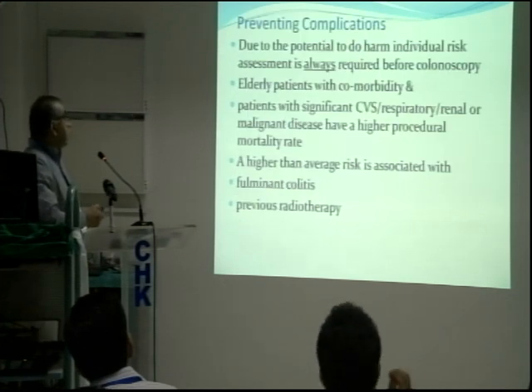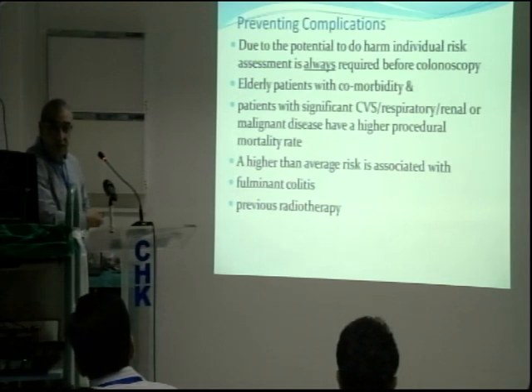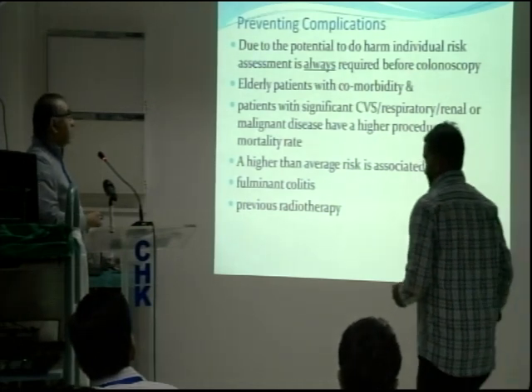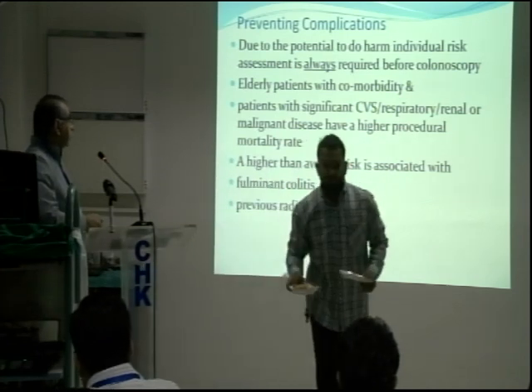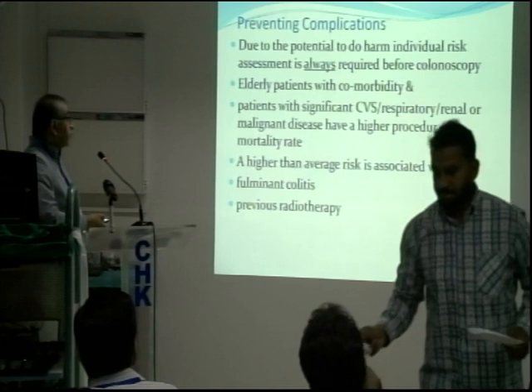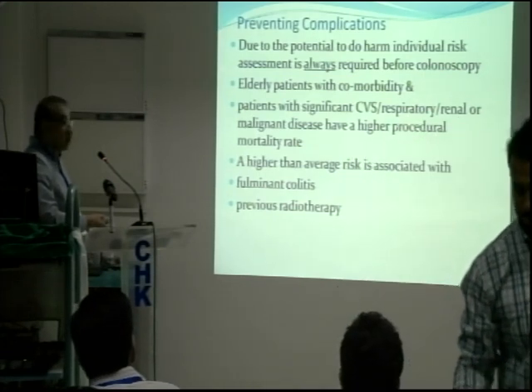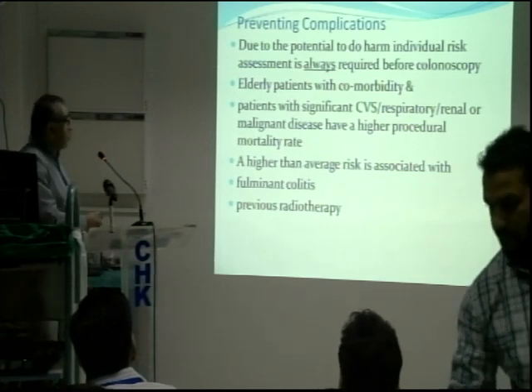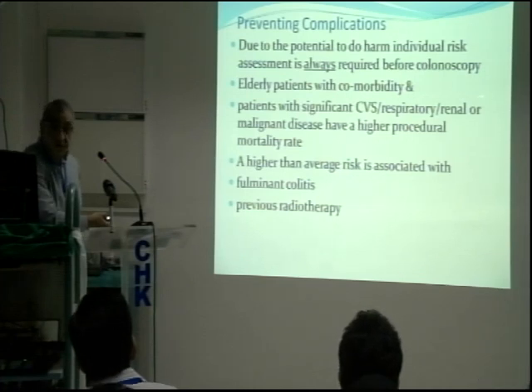Right, okay, so preventing complications, it's always better to prevent than cause a complication. You can cause significant harm during colonoscopy. So always consider whether the patient really needs that procedure, whether it's indicated or not. Elderly patients who have significant comorbid factors have a higher procedural mortality rate. So be careful in selecting colonoscopy. Most of the time, I wouldn't even do a colonoscopy in these patients. I would do a CT colonography.